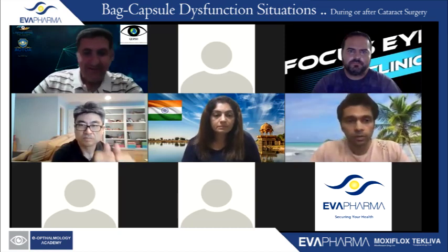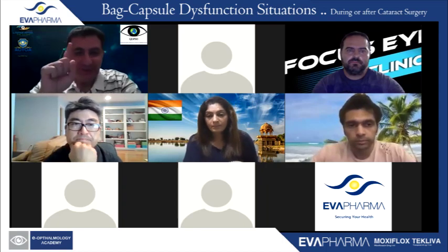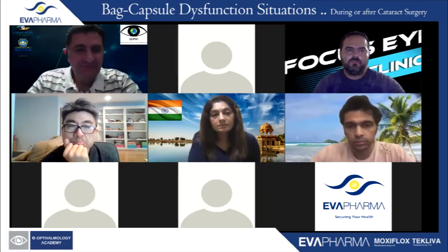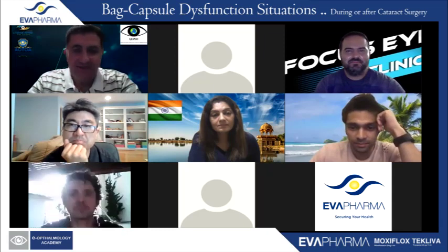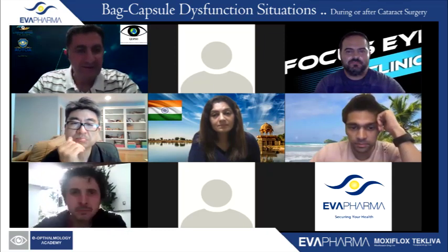Thank you, Lukan, so much. It's very interesting. And just one comment, it's very lovely that you do the video editing. You put two screens and you enlarged one in the edge of the screen. This is very nice. You are showing your technique and highlighted by the other video.